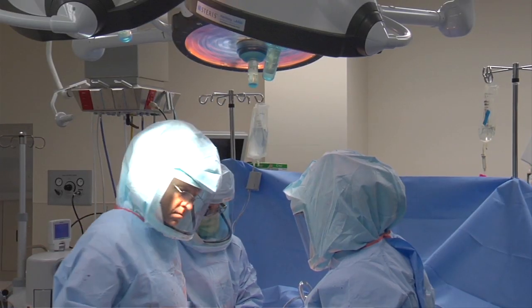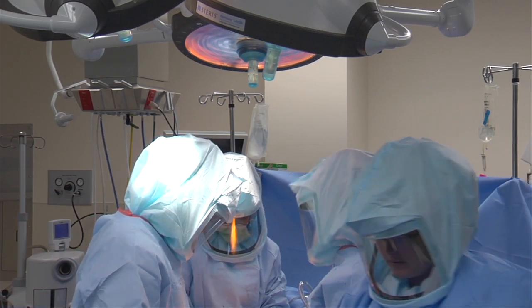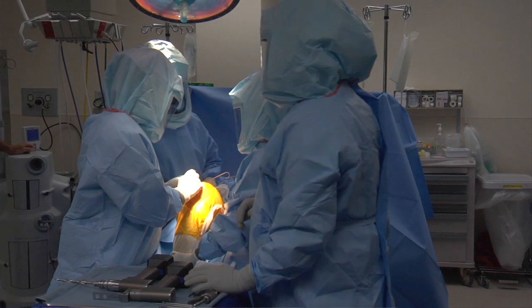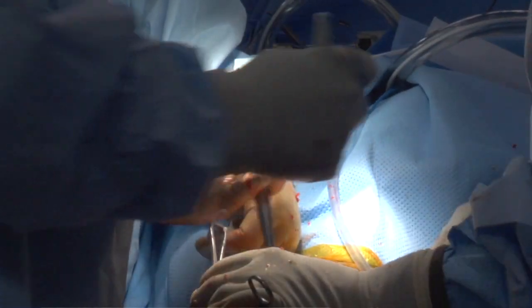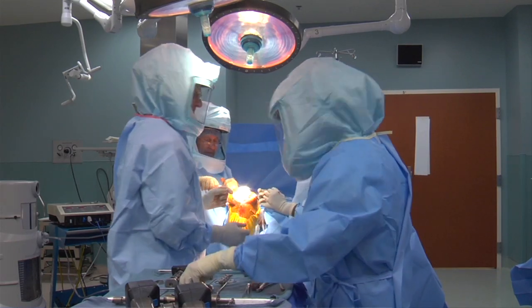When we do a total knee replacement, we make an incision over the front of the knee. We cut next to but not into the quadriceps tendon and reflect the kneecap to the side. That gives us an on-face exposure of the femur and the top of the tibia. We then use an instrument to cut and shape the end of the femur so that we can put the femoral component on.